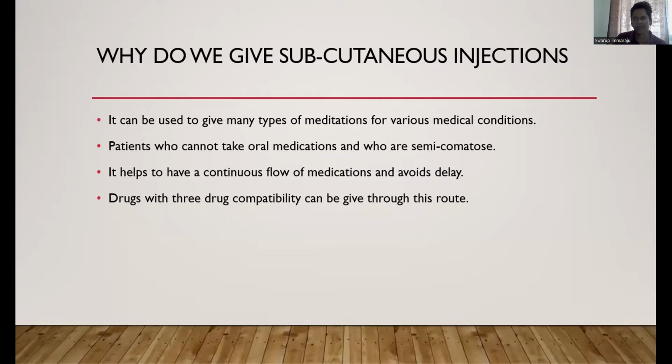So when there are patients with a lot of uncontrolled pain, you have to think about what would be the choice of action. Instead of frequently wasting our time sitting there and spending a lot of time administering the medications, you can just do one single thing: connect it to the subcutaneous infusion, and run it for a while so that you'll have time to see other patients. So that's how it is more helpful for the nurses even. And also it is beneficial in avoiding the delays.